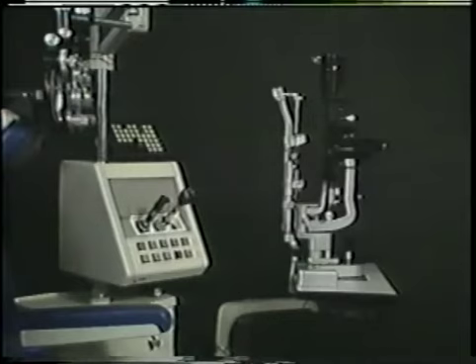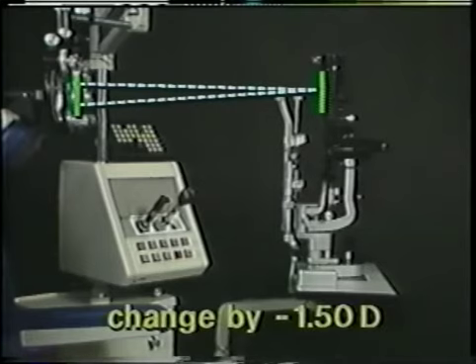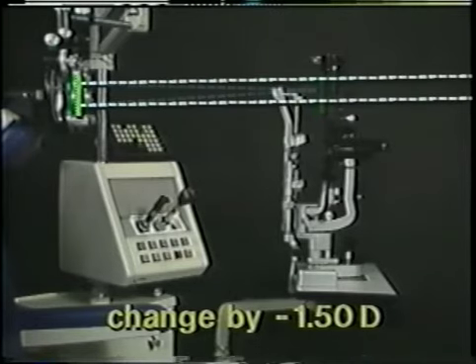When the neutralization procedure is finished, the eye will be focused exactly at the working distance. Then, by changing the spherical portion of the refractive correction by 1.5 diopters in the minus direction, the eye's focus is moved out to infinity, or, practically speaking, to the visual acuity chart on the far wall. So, establishing a constant working distance is important.